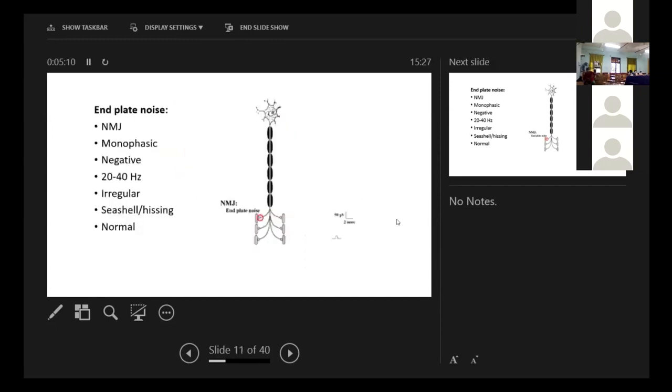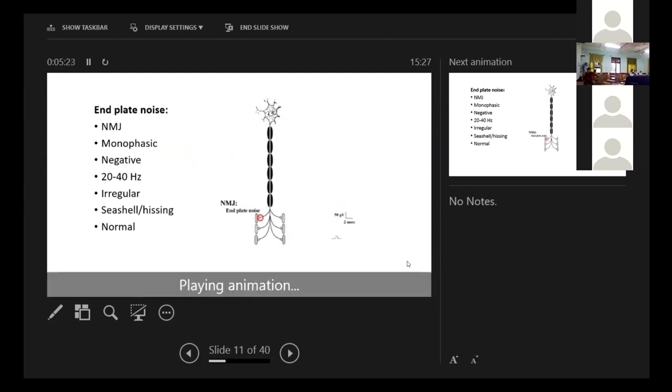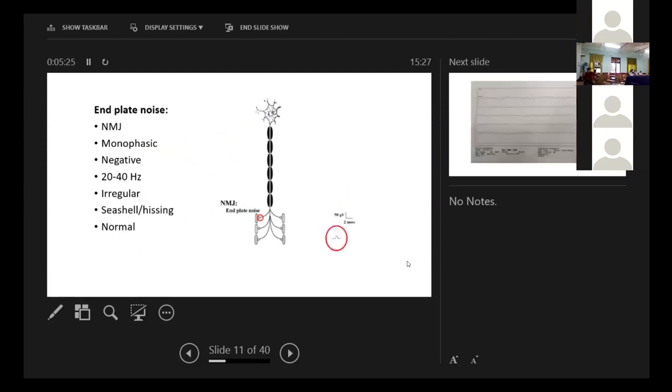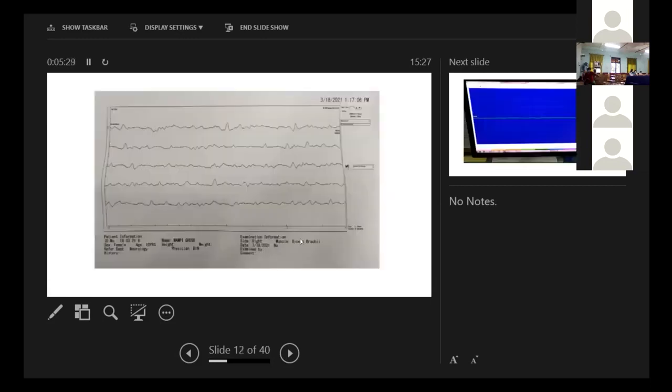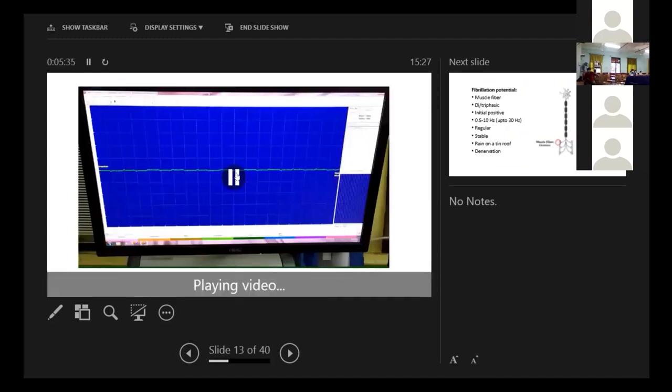These are the types. Suppose there's an end plate noise seen coming from the neuromuscular junction. This is the end plate region from the anatomic location. It will sound like C shell or hissing sound. And it's a normal thing. So this is the kind it will look. This is the tracing how it will look. And on the monitor, how will we see that? We will see a tracing going on.